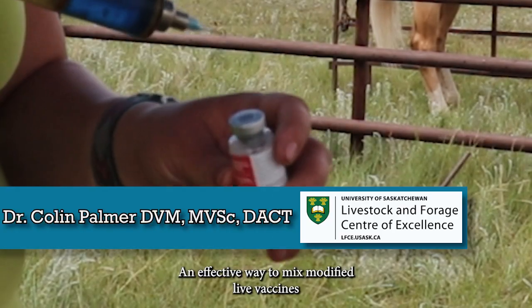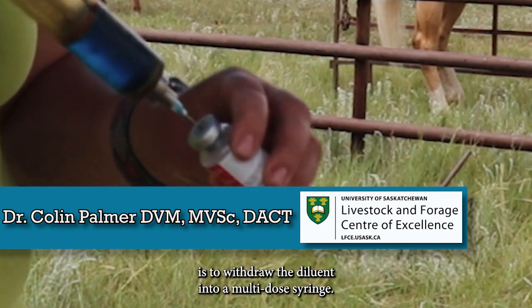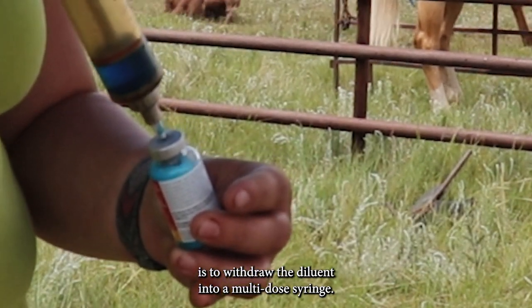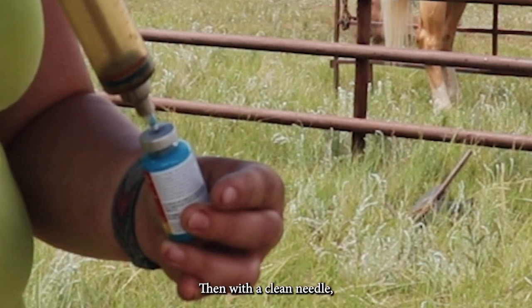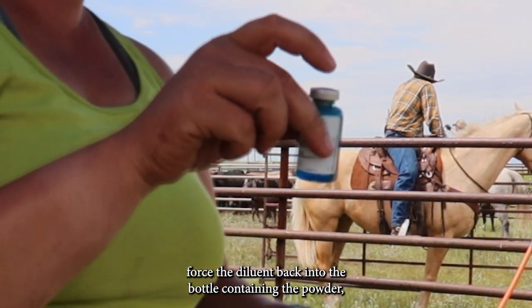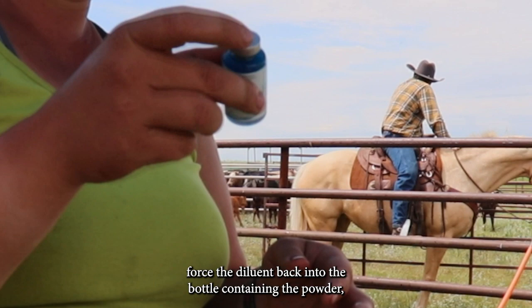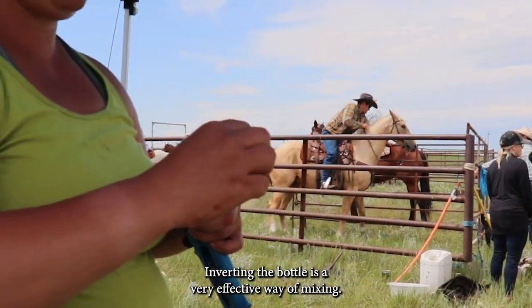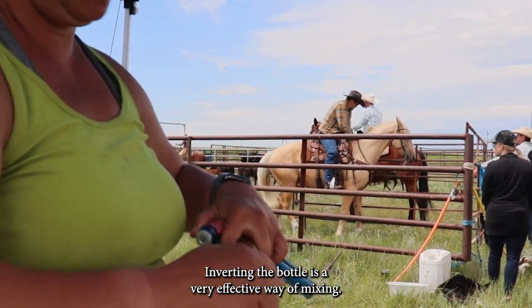An effective way to mix modified live vaccines is to withdraw the diluent into a multi-dose syringe, then with a clean needle, force the diluent back into the bottle containing the powder. Then gently mix the powder and diluent together. Inverting the bottle is a very effective way of mixing.